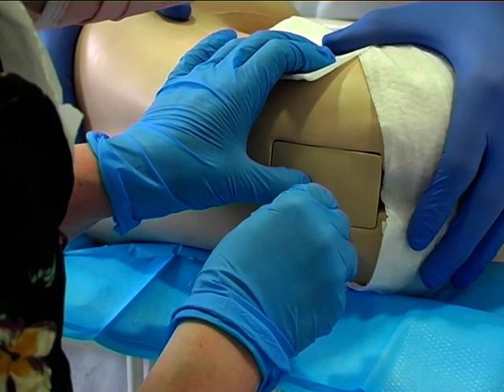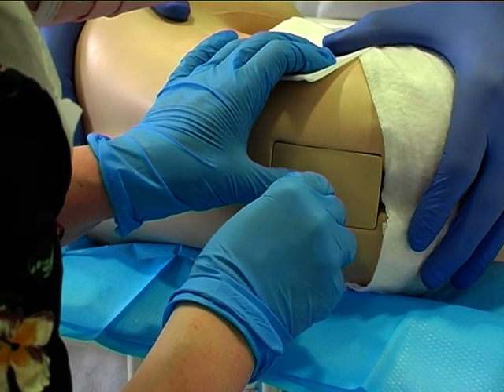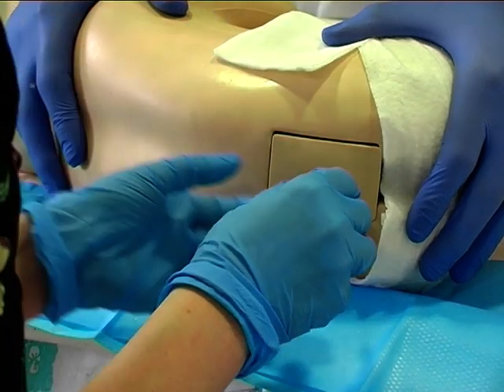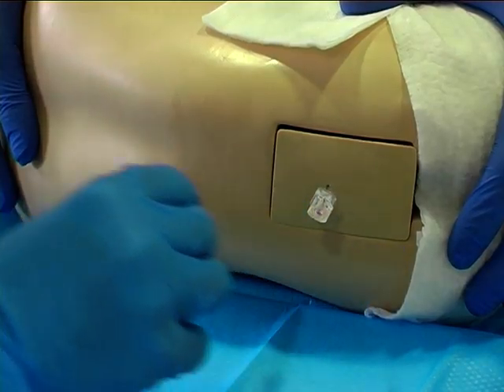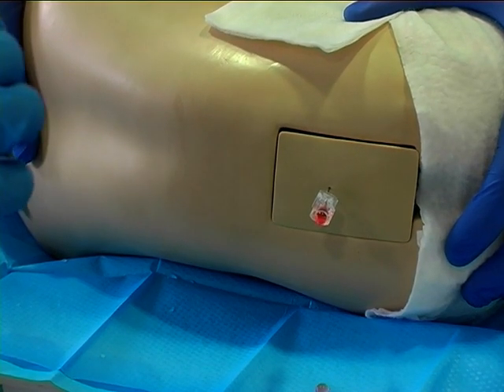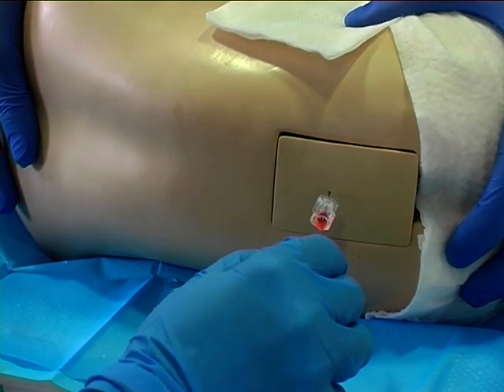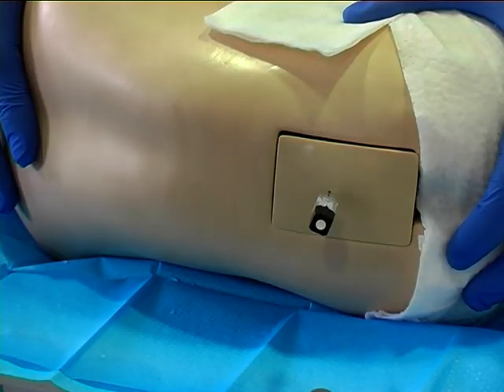If the situation occurs where you have inserted your lumbar puncture needle, remove your stylet and obtain a frankly bloody sample, we suggest replacing the stylet and removing the lumbar puncture needle at this point, as it is highly likely to yield an uninterpretable or fully traumatic CSF sample.